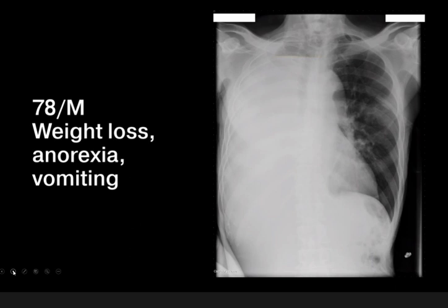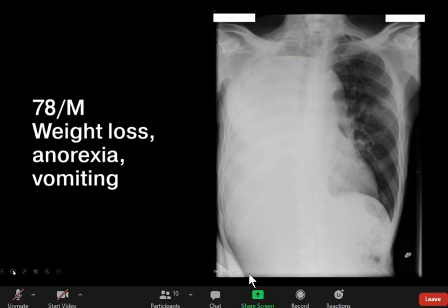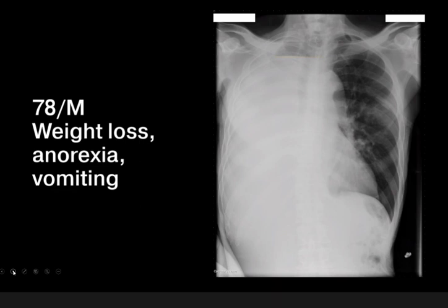hydropneumothorax, but in this case, we will note that the air fluid level does not reach the lateral chest wall, and also that the trachea is shifted towards the opacified side. So this is unusual for a hydropneumothorax. If it doesn't reach the lateral wall, we would be thinking that there's something limiting the fluid. Could it be due to an abscess, or is it a lung cancer with central cavitation, which can also develop an air fluid level? But if we look at the position of this, it's near the apical region, so it's unlikely to obstruct the right main stem bronchus if it is some sort of mass.